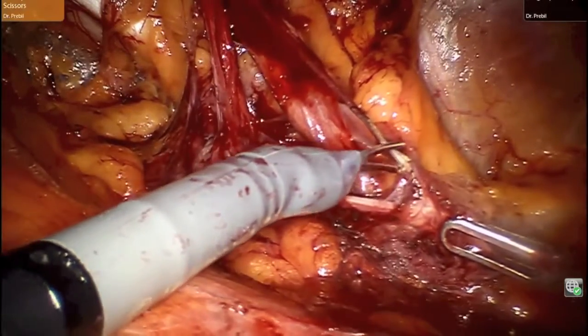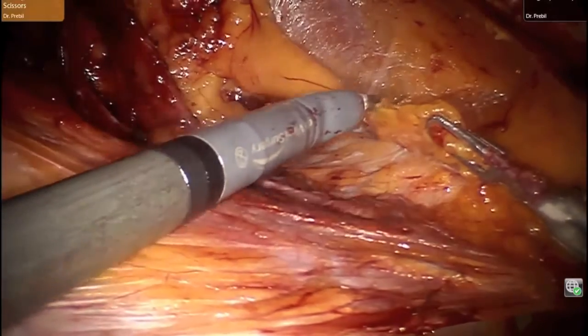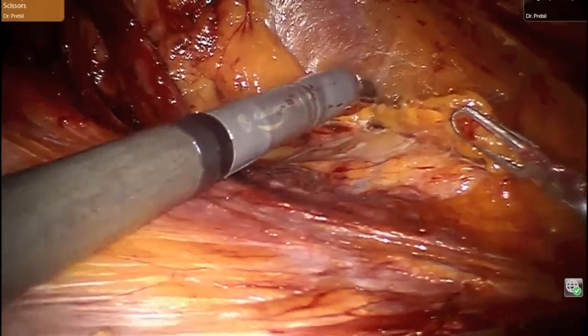Continued dissection of the peritoneum off its retroperitoneal structures is important in order to allow deployment of a wide sheet of mesh.